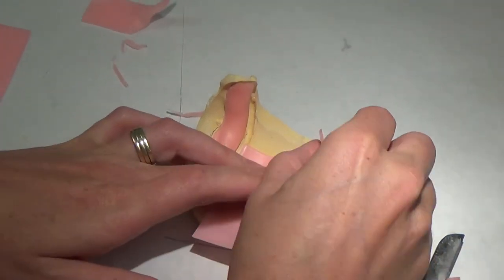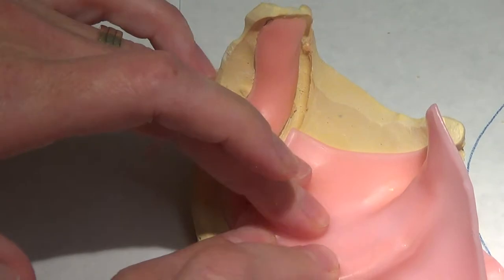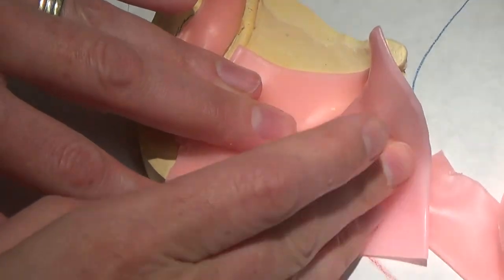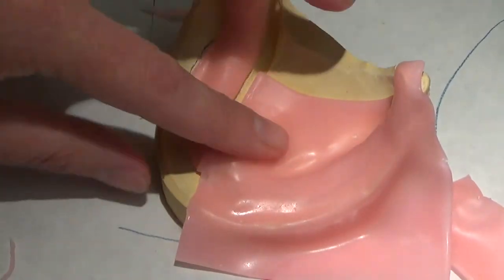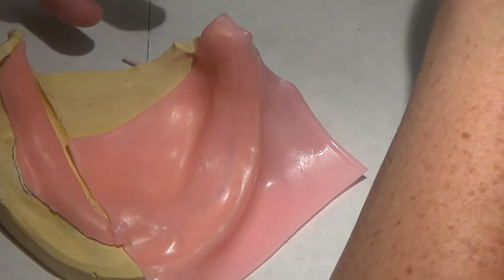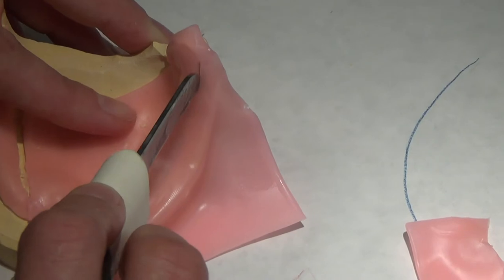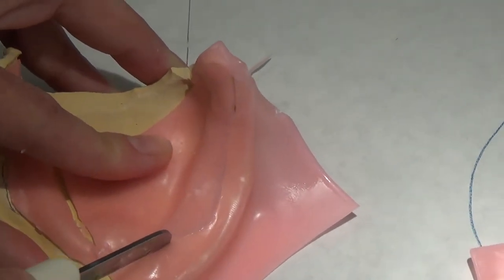I'm going to slightly overlap the wax there at the midline, not significantly, just a little bit. When you have a resorbed ridge like this, sometimes you have to adapt this wax kind of around initially to get it to adhere to the cast. As it's warm, it's a little bit more translucent, so if I trim this right away, I can take advantage of that and I can see my line.